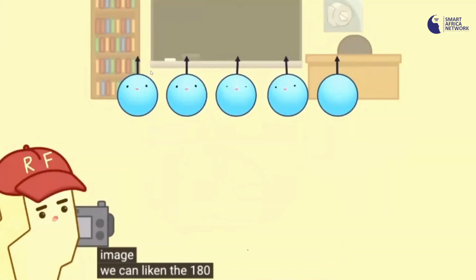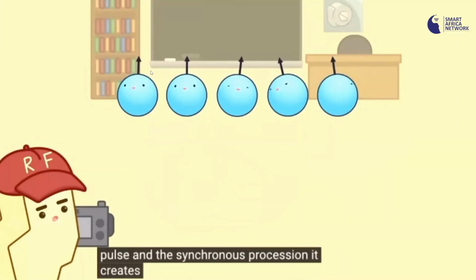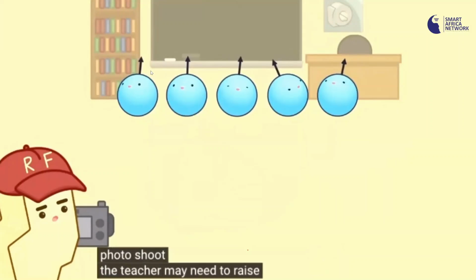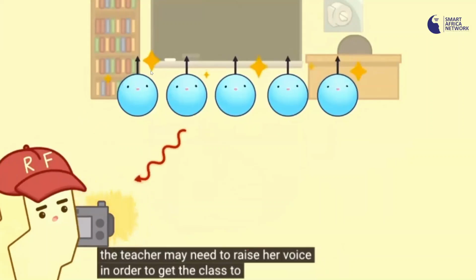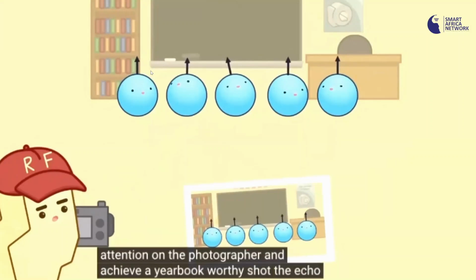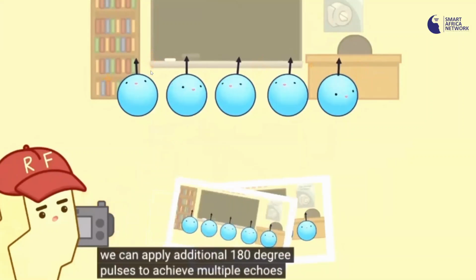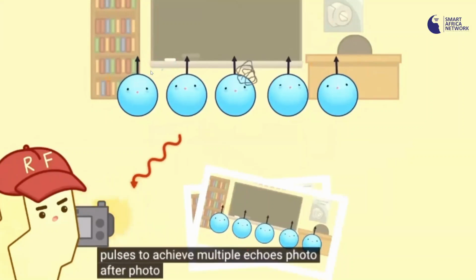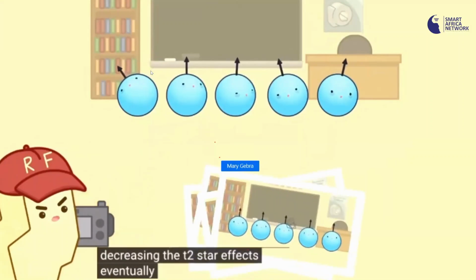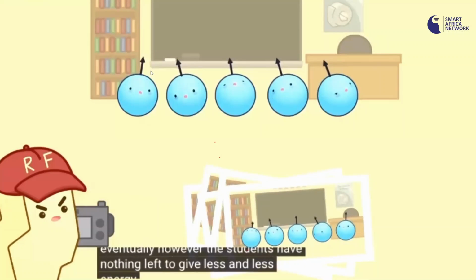medical image. We can liken the 180-degree refocusing pulse and the synchronous precession it creates to an elementary school class photo shoot. The teacher may need to raise her voice in order to get the class to focus its attention on the photographer and achieve a yearbook-worthy shot, the echo. We can apply additional 180-degree pulses to achieve multiple echoes, photo after photo after photo, to continue decreasing the T2 star effects. Eventually, however, the students have nothing left to give.